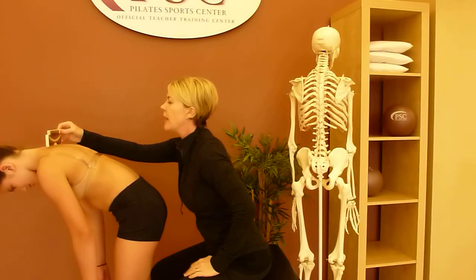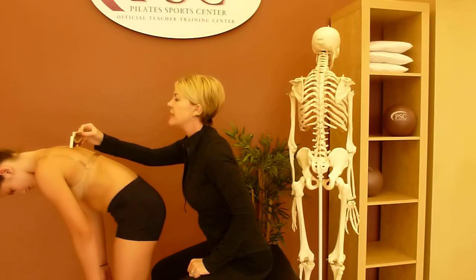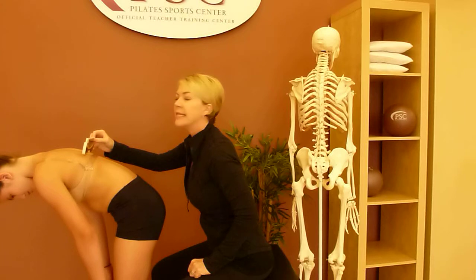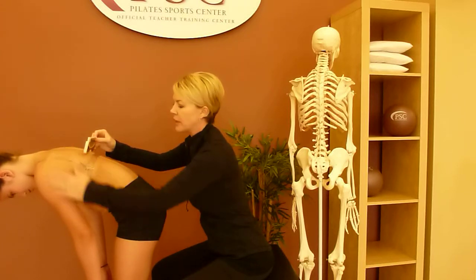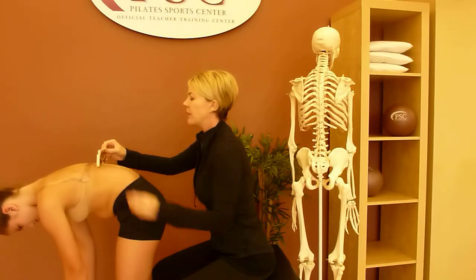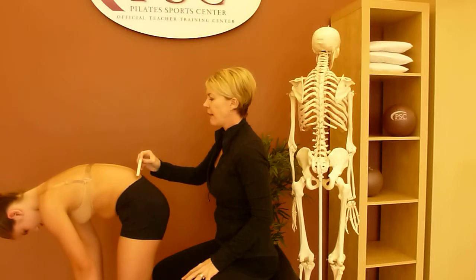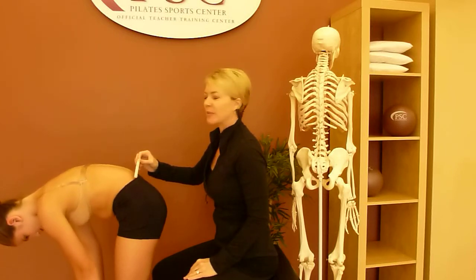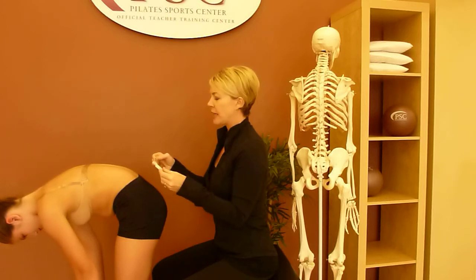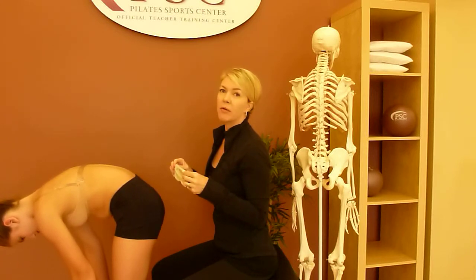We're going to start to notice any deviation in degrees going right to left. We might want to stop and mark these measurements down, or perform the test again and mark them as we go. When we reach about the mid-back T7 bra line area, we're going to have her fold a little further until the lumbar spine is parallel to the floor, and we're going to continue incrementally down her spine until we reach the hips. You will notice the movements, and you'll notice maybe five to ten degrees in any given area. About five degrees should alert you to start to be concerned or refer them out for evaluation.